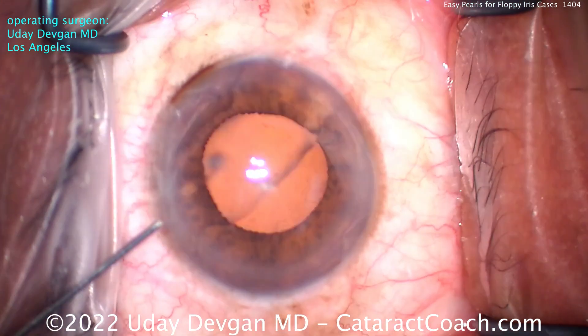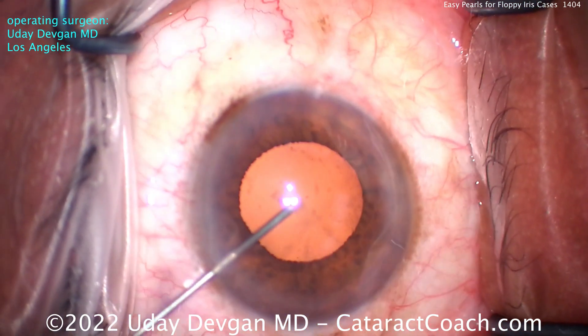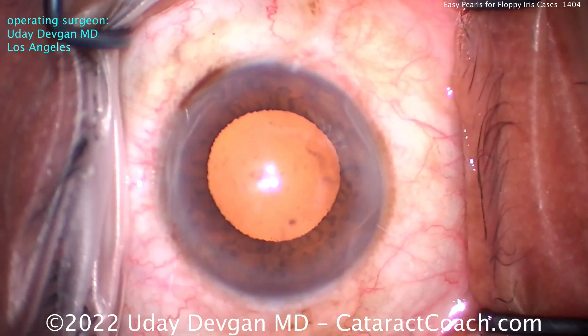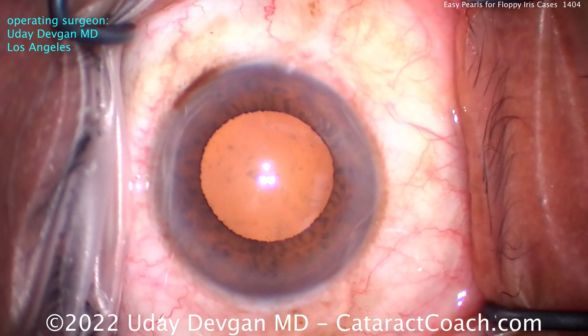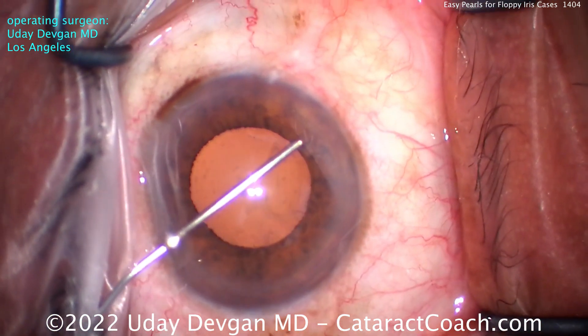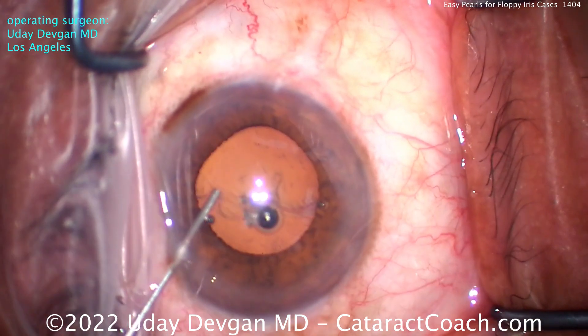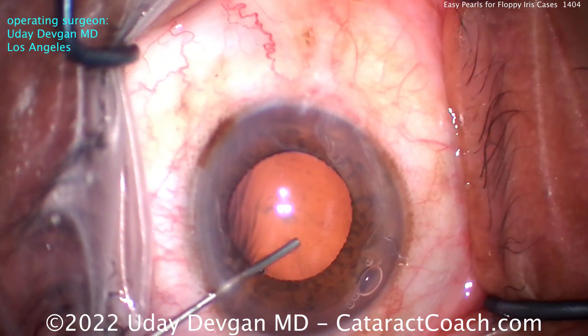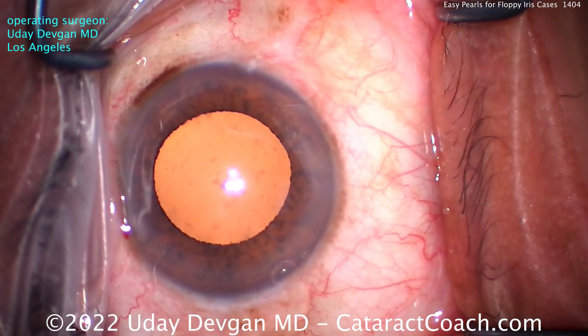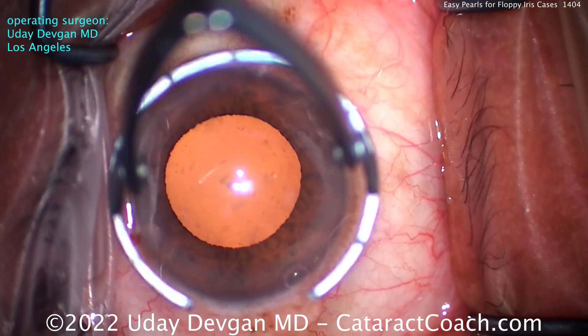It looks pretty well dilated now, but as we start doing the case, we inject our anesthetic inside the eye and the pupil gets a little bit bigger. We know ahead of time this patient's been taking Tamsulosin for many years and he's going to have floppy iris. We fill the eye with our viscoelastic — important to do a little viscomydriasis there. Get that pupil expanded a little more with the viscoelastic.